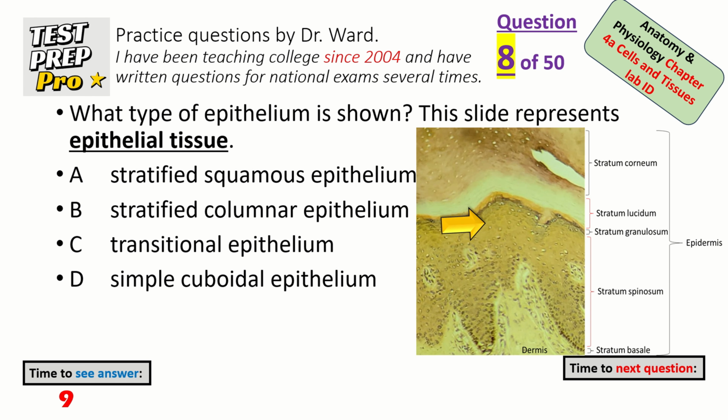What type of epithelium is shown? This slide represents epithelial tissue. It's an image of the epidermis. Stratified squamous epithelium.